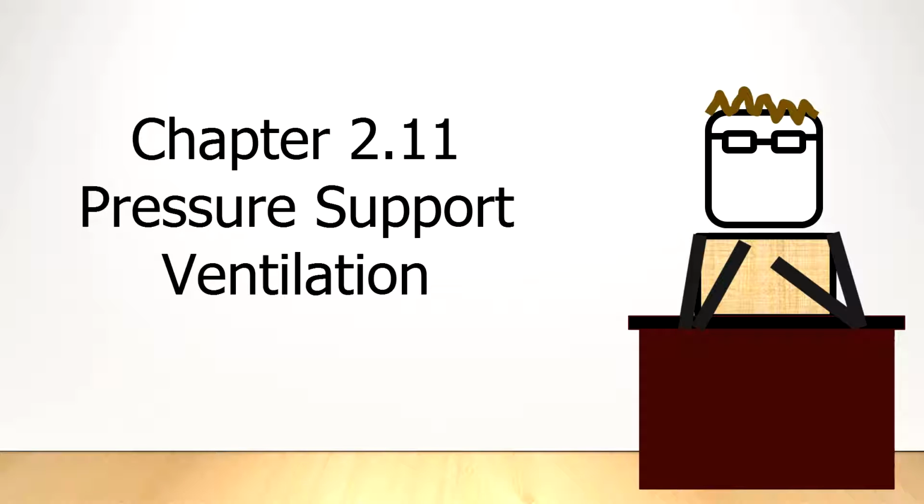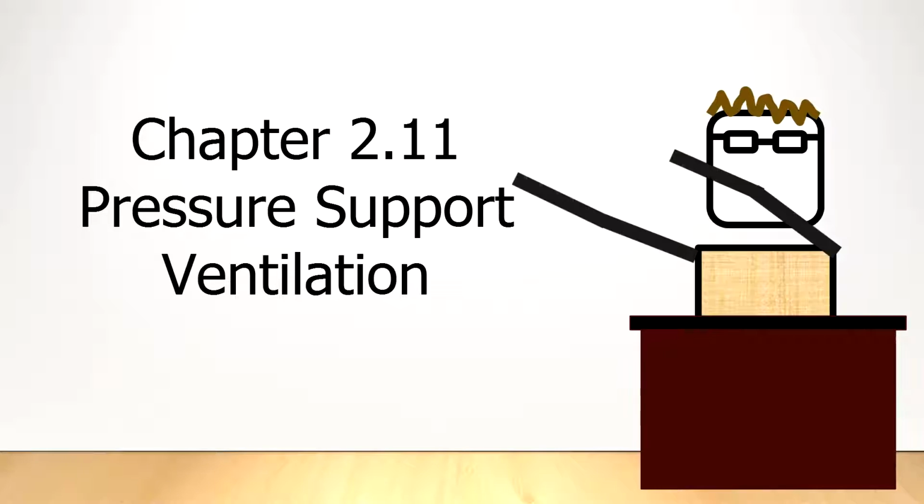Welcome to a basic introduction to mechanical ventilation. This is chapter 2.11, pressure support ventilation.